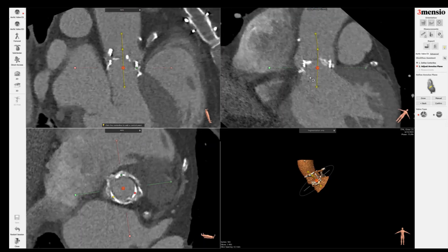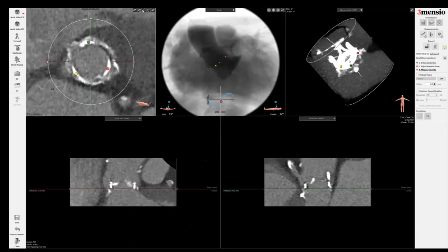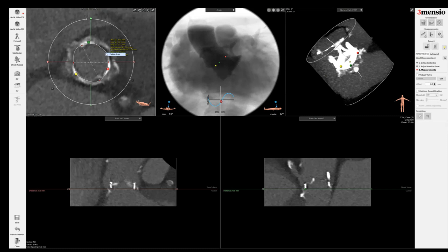Once you're satisfied with this measurement, then you click confirm and then you can trace the annulus. It's important that you drop the gain before you start measuring, because often the surgical valve frame will have artifact or blooming. If you have blooming, you can artificially underestimate or make the annular area smaller than it really is.